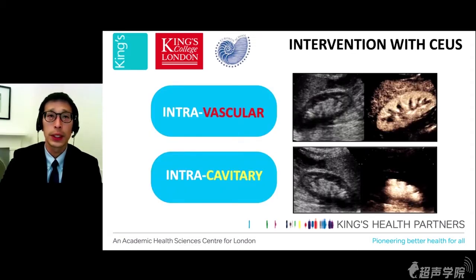And with intervention with contrast ultrasound, we need to think about the application and the questions we want to have answers for. And contrast-enhanced ultrasound can be performed either intravascularly or within a cavity, or intracavitary use of contrast ultrasound.